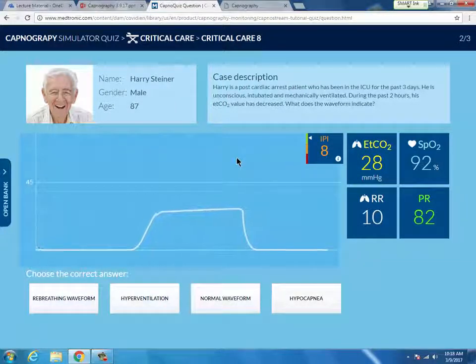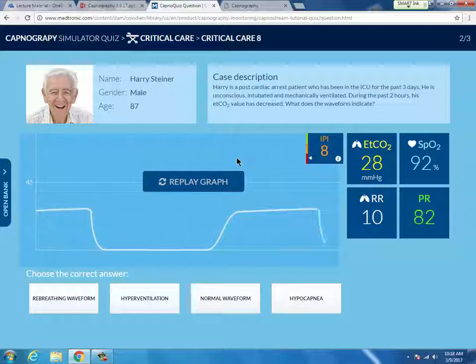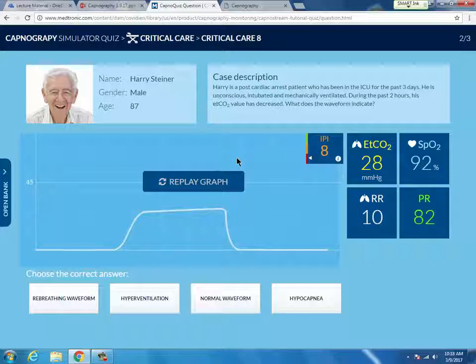Oh, yeah, you were talking about if it was an obstruction in the tube, you're usually not going to have a partial obstruction. That tube is so small that if there's crap that gets in there, it's not usually going to be able to make any waveform. With her, I would be checking the tube to see what's up with that. And I can guarantee you, if she's on a ventilator, it isn't going to take the CO2 alarm to get your attention. The way she was breathing on that ventilator, it's going to blow up, making all kinds of noise.